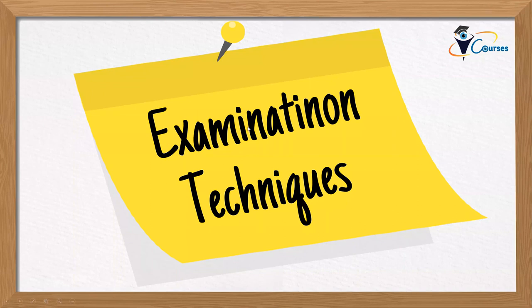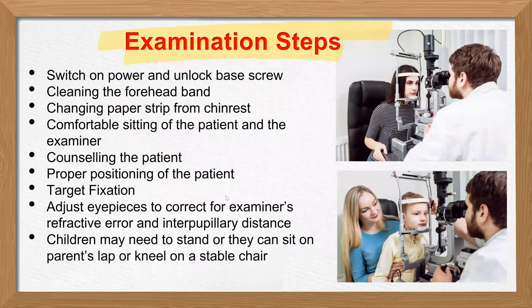Okay, so we have here an examination technique. And the examination technique, this is the most important part here: what are the different examination techniques, either direct or indirect? So let me first start with the examination steps. How can we examine the patient?